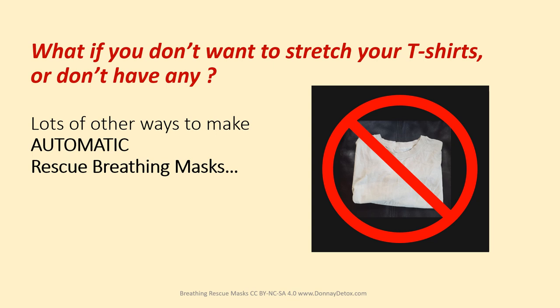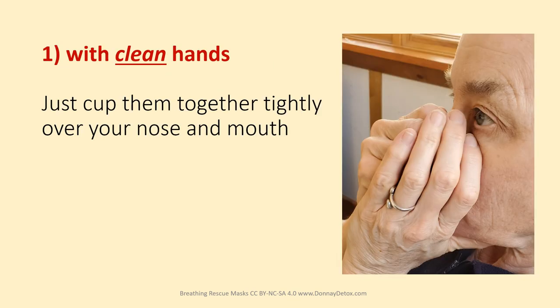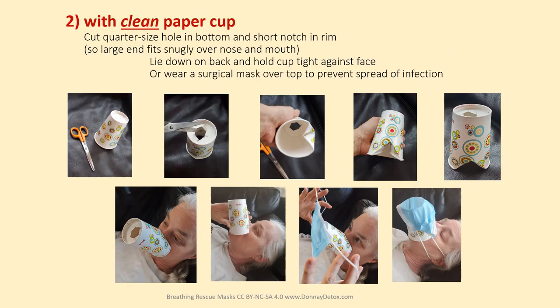What if you don't want to stretch your t-shirts or don't have any? There are lots of other ways to make automatic rescue breathing masks. With clean hands, just cup them together tightly over your nose and mouth. With a clean paper cup, cut a quarter-size hole in the bottom and a short notch in the rim so the large end fits snugly over your nose and mouth. Then lie on your back and hold the cup tight against your face, or wear a surgical mask over top to prevent the spread of infection.